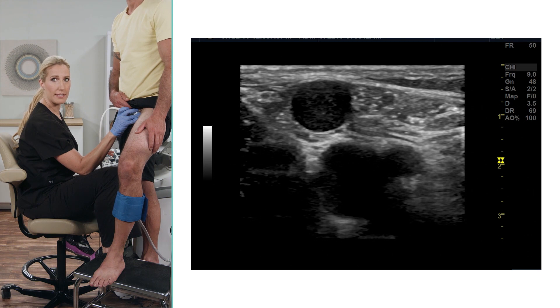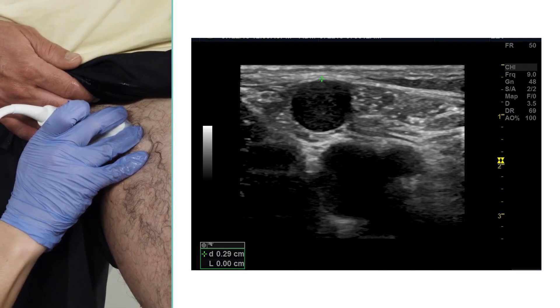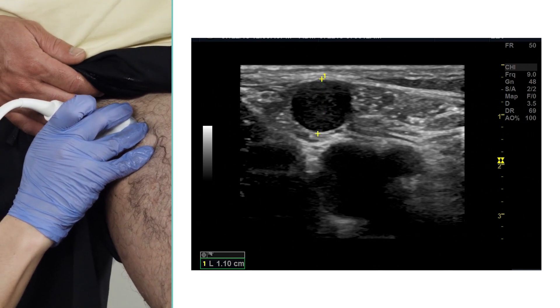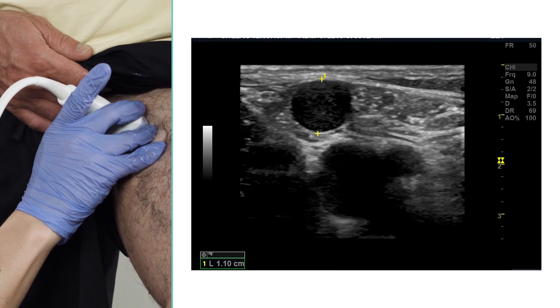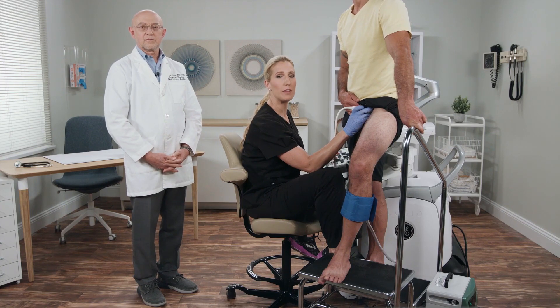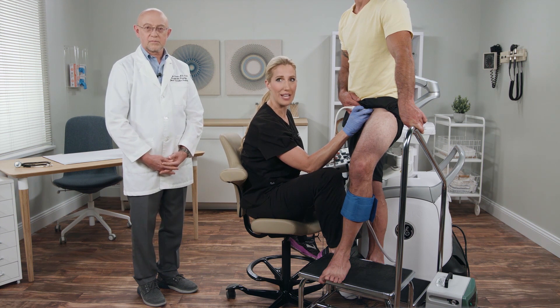I'm going to measure this vein to see what the diameter is. This vein measures 1.1 centimeters. We will now proceed with the spectral pulse wave Doppler portion of the evaluation to assess for reflux in this region of the great saphenous vein.